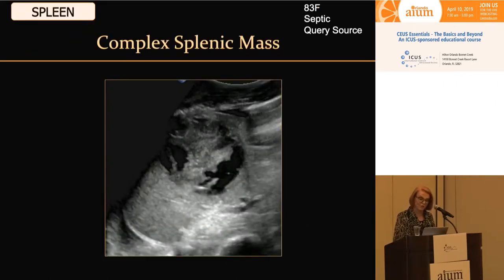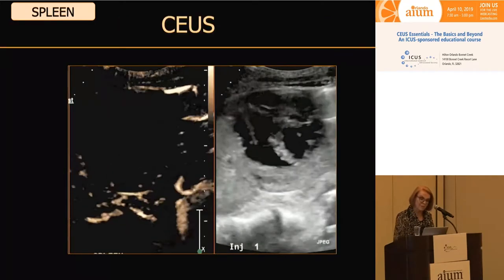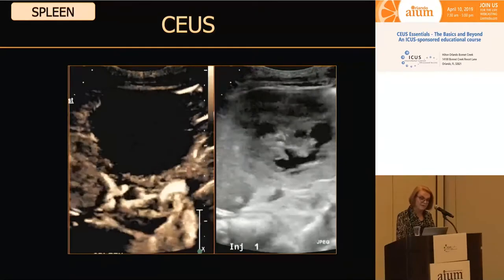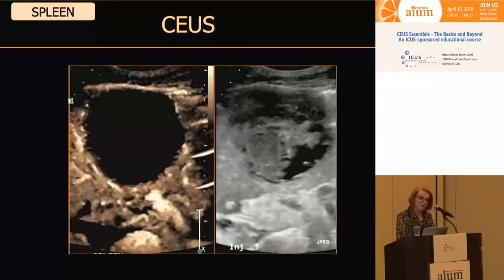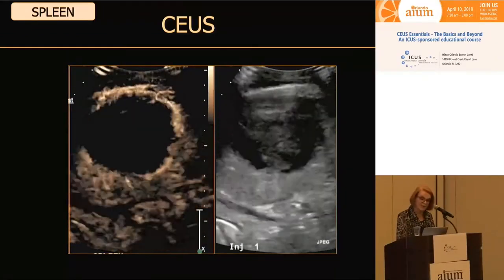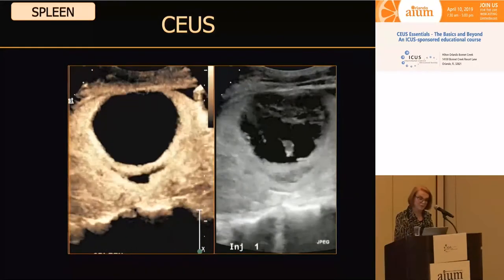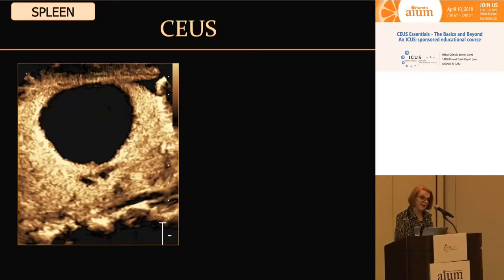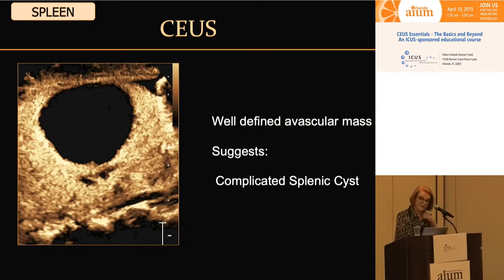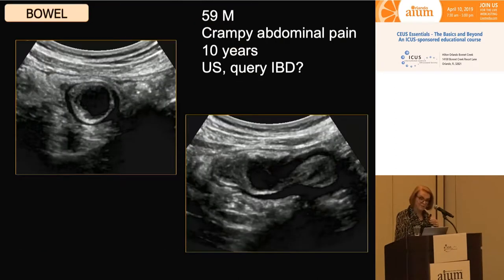Here's an 83-year-old female — still looking at the spleen. She's septic, and they're looking for a source of sepsis. She has a somewhat bulbous spleen and a large complex mass in her spleen. Could that be a source of sepsis? Certainly it could be. But on our contrast examination, the mass is very well-marginated, with no enhancement within any of the solid components and no evidence of hyper-enhancement of the surrounding splenic tissue. This would likely be some kind of complex cystic lesion and probably not playing a role in her sepsis. A well-defined avascular mass suggests a complicated splenic cyst.